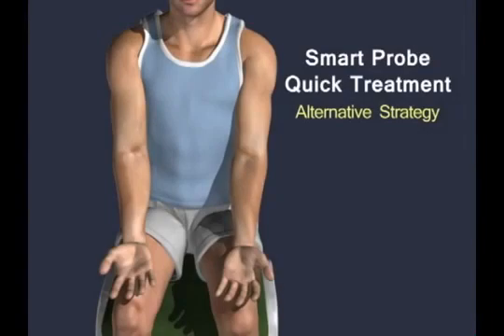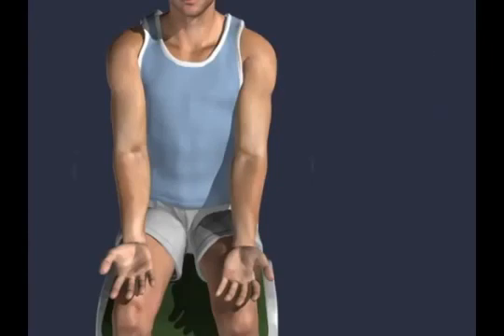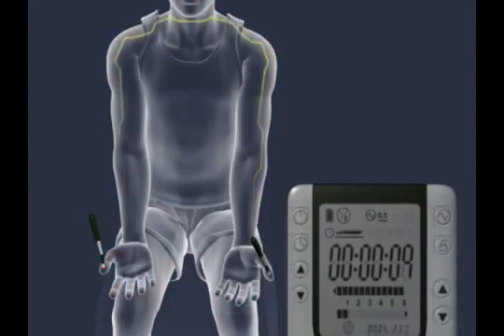Smart Probe Quick Treatment Alternative Strategy. To treat the neck and arms, including the fingers, hands, wrists, elbows, and shoulders, connect your 2 hands by placing one smart probe on one fingertip and the other smart probe in the same place on the corresponding fingertip of the other hand for 10 to 20 seconds. In other words, treat thumb tip to thumb tip, index finger next, for all 5 fingers.